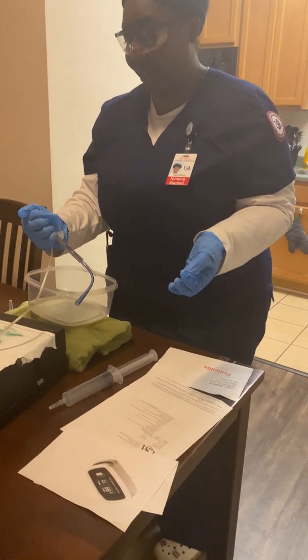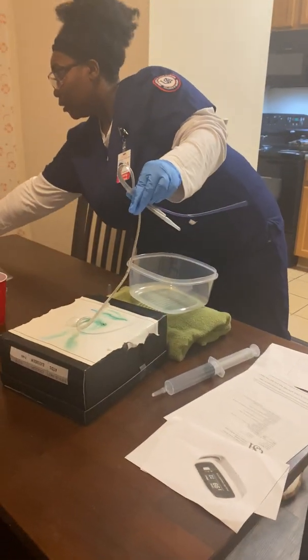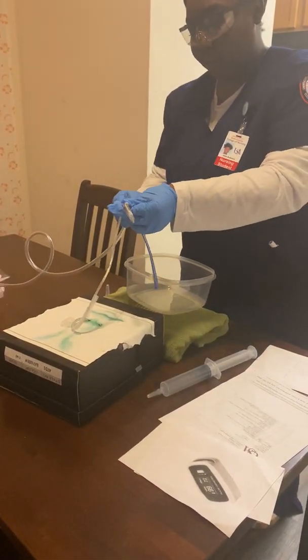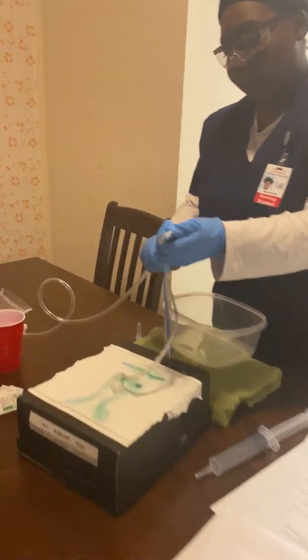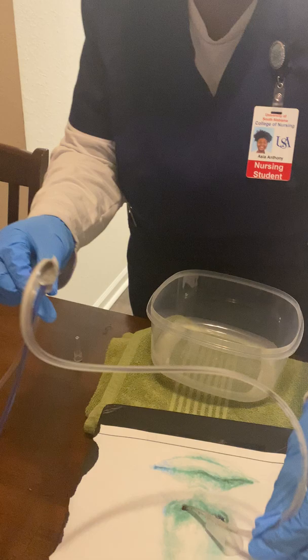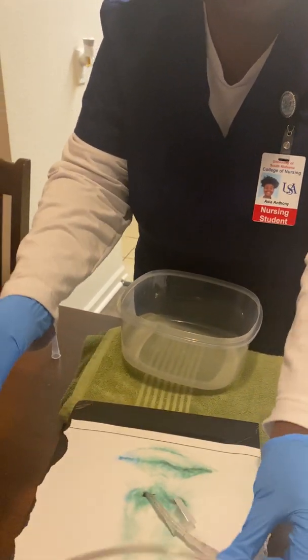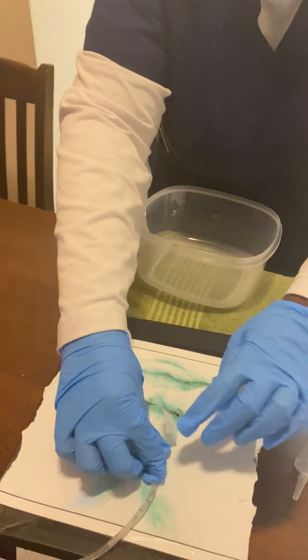And then after I have done that, I am going to connect this to suctioning, like so. My tape has apparently come up, but I will state that that has been noted, and I will place this above the stomach.